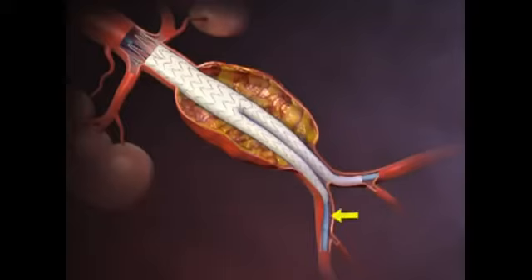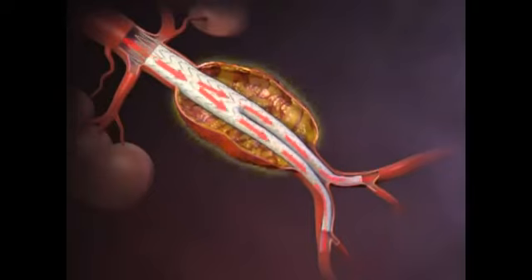The ipsilateral limb of the stent graft is deployed in similar fashion. A balloon is then introduced and used to expand all graft-to-vessel and graft-to-graft junctions in the proximal to distal direction to ensure a tight seal. Finally, the sheaths and guide wires are removed and the femoral arteries repaired. Aortic blood subsequently flows through the stent graft. Endovascular abdominal aortic aneurysm repair is intended to relieve further pressure on the aneurysm.